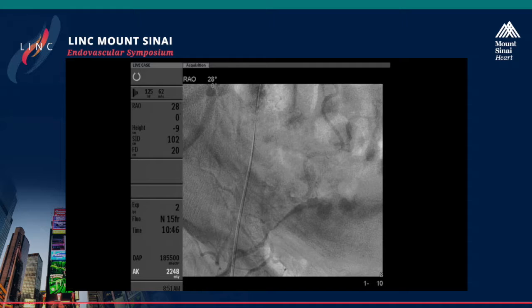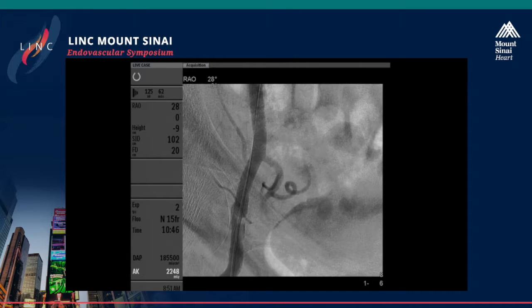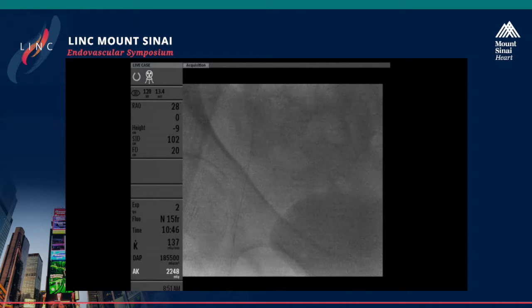On the other hand, this is an old lady, so if there would be an indication to use a stent, nitinol stents are performing very well in this position. A short stent, 2 centimeters only, will maintain patency over a decade without any problems. And there's a French study which already compared stenting with surgery, and they have shown equivalent outcome for stenting. So the question, would you use a drug-coated stent or just a regular nitinol stent here, Tom? Regular nitinol stent usually.